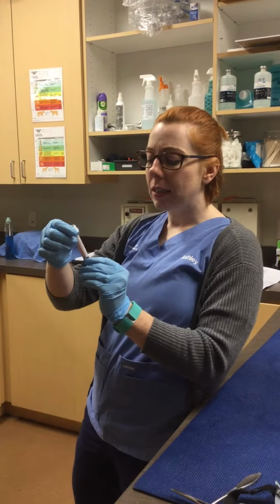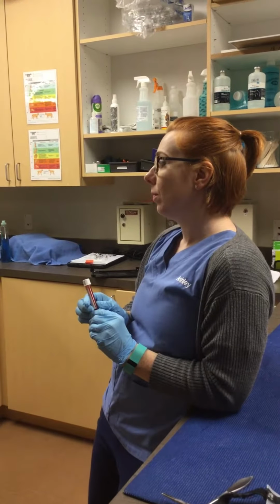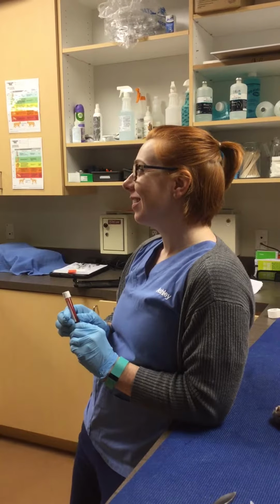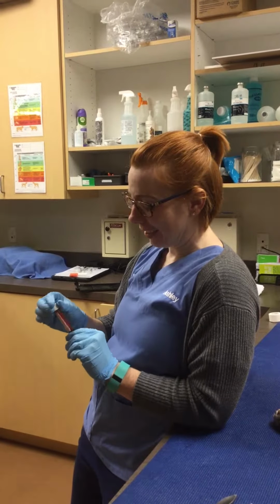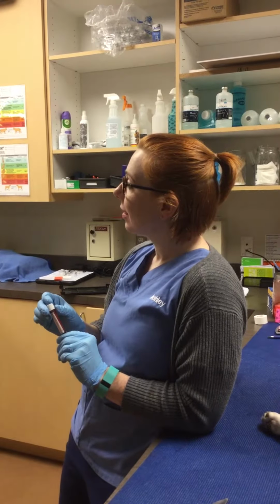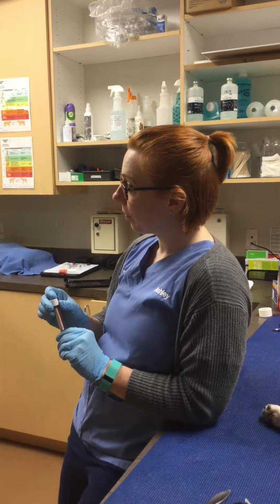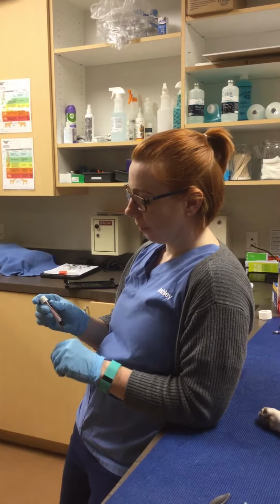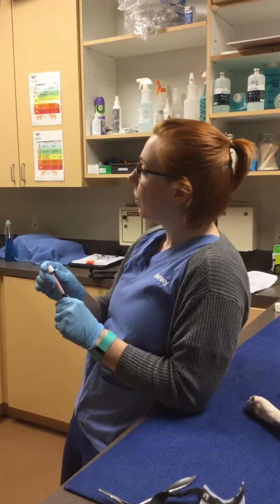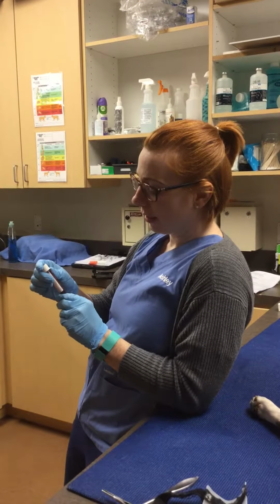So at 10 seconds, I still don't have a clot. It's another 10 seconds. So now we've reached 1 minute. And I'm still going to keep checking until the clot forms. Another 10 seconds.